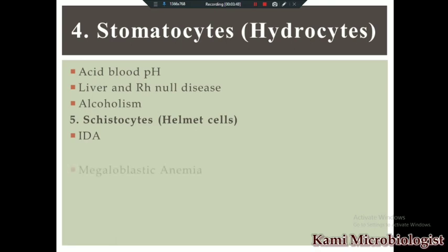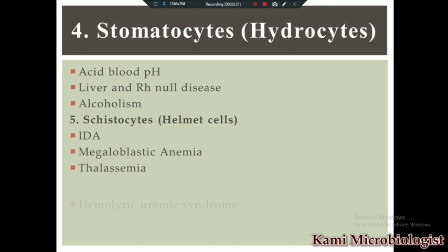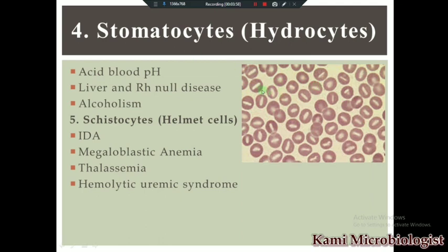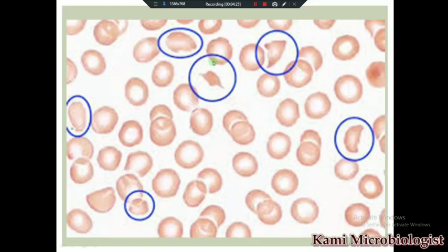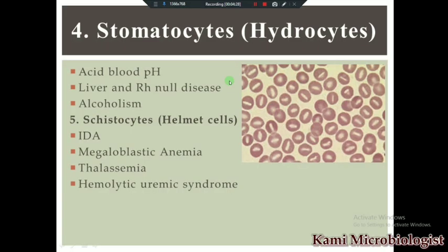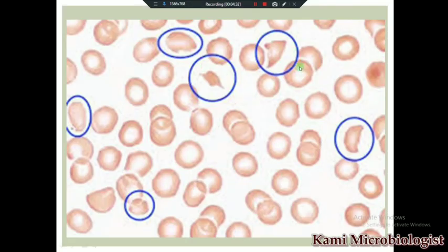Then we have schistocytes, also called helmet cells. Schistocytes are present in cases of iron deficiency anemia, megaloblastic anemia, thalassemia, and hemolytic uremic syndrome. Looking at the images: stomatocytes have a slit-like pale center — the RBC appears divided into two forms. Schistocytes look like a helmet shape when viewed under the microscope.